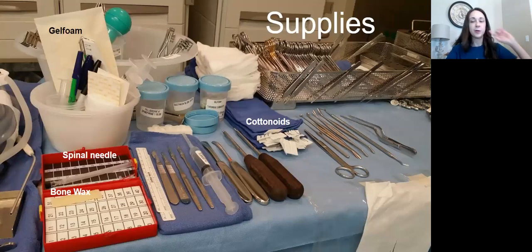There's a lot more in your book. You do need to read it all. I'm just pointing out some of the big things for you. Okay, routine supplies. So it says basic pack. You're typically going to have a neuro pack. Some facilities have cranny pack and spine pack. Some are even more precise. So make sure you're reading the names of your packs.